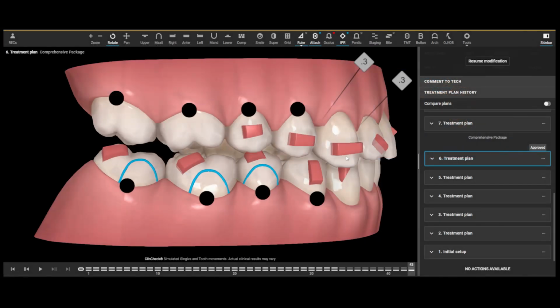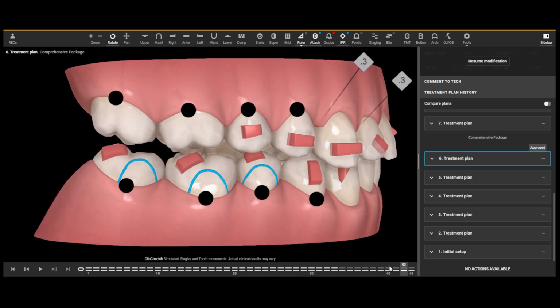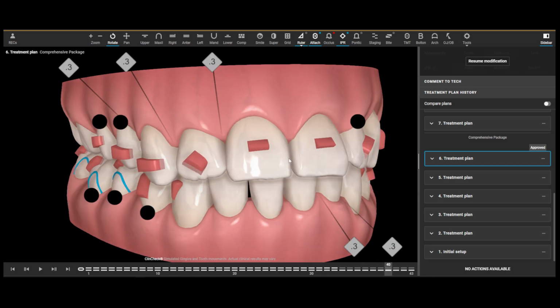So here's our plan, right? We kept it at 40-ish trays. Our last trays here, they're all passive, so nothing's changing or moving. Pretty easy setup.